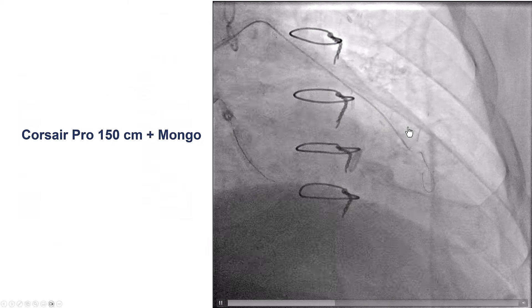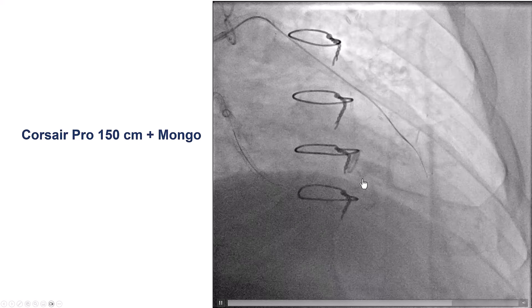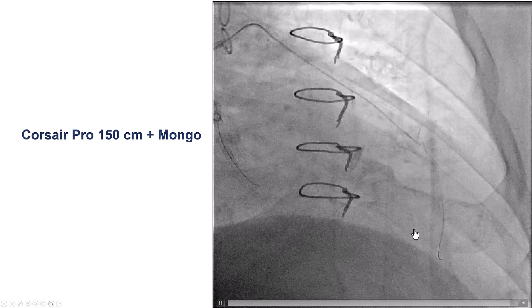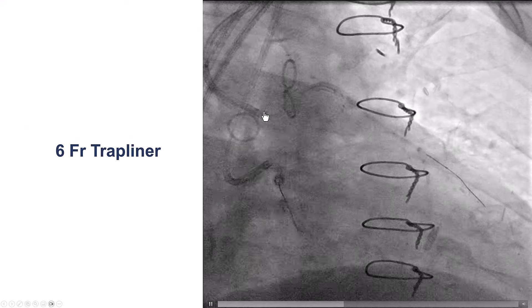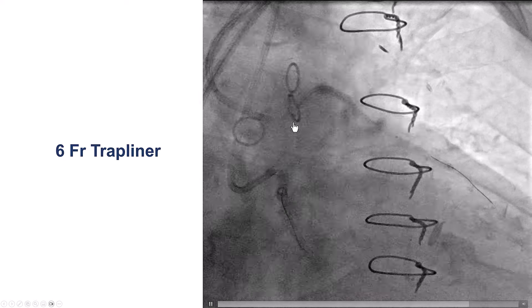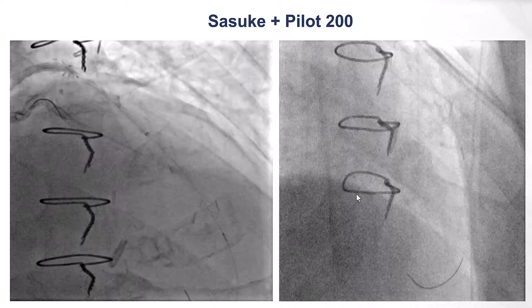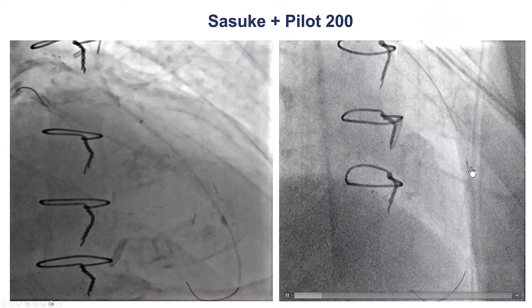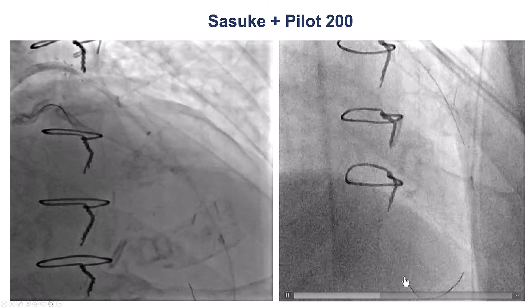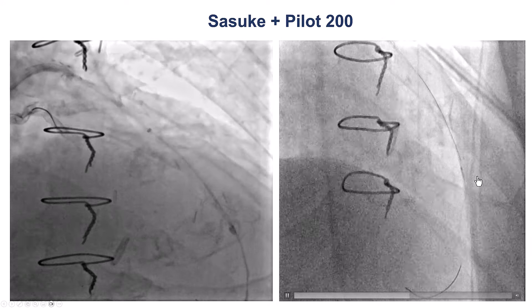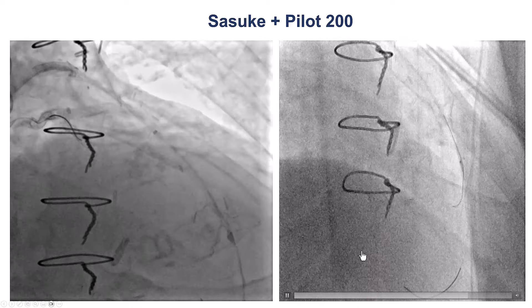We attempted to go retrograde. We used a polymer jacket guidewire — a Gladius Mongo — which had some difficulty going retrograde. To get better support, we inserted a 6-French trapliner, and then used a dual-lumen microcatheter, as we had done in the previous case. Using the dual-lumen, we were able to advance a Pilot 200 guidewire retrograde into the LAD.